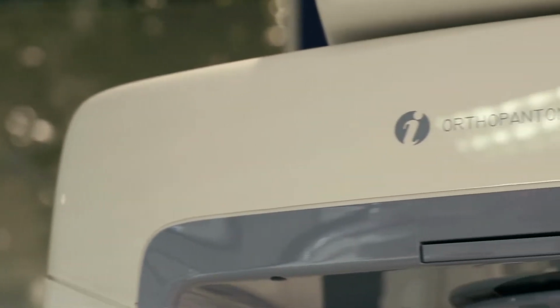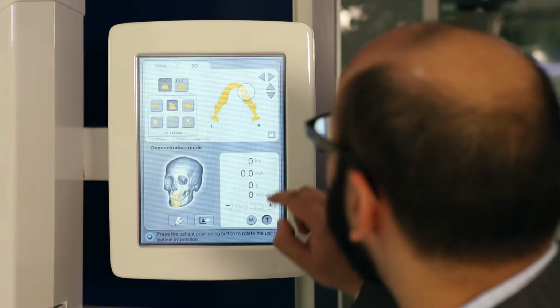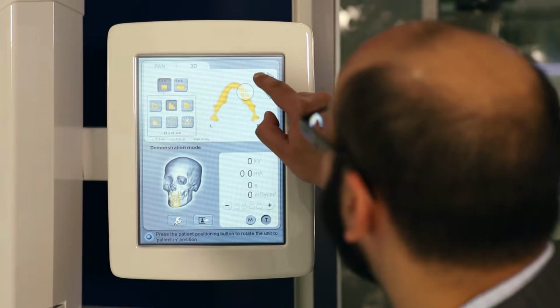Radiography is such a valuable diagnostic tool in dentistry, and cone beam CT lets us visualise the patient's tissues in a way that is just not possible with 2D imaging. We get this high resolution, three-dimensional virtual model of the patient's tissues that we can view in any orientation or in any plane. We can see the exact location of the mandibular canal in relation to lower third molar roots.